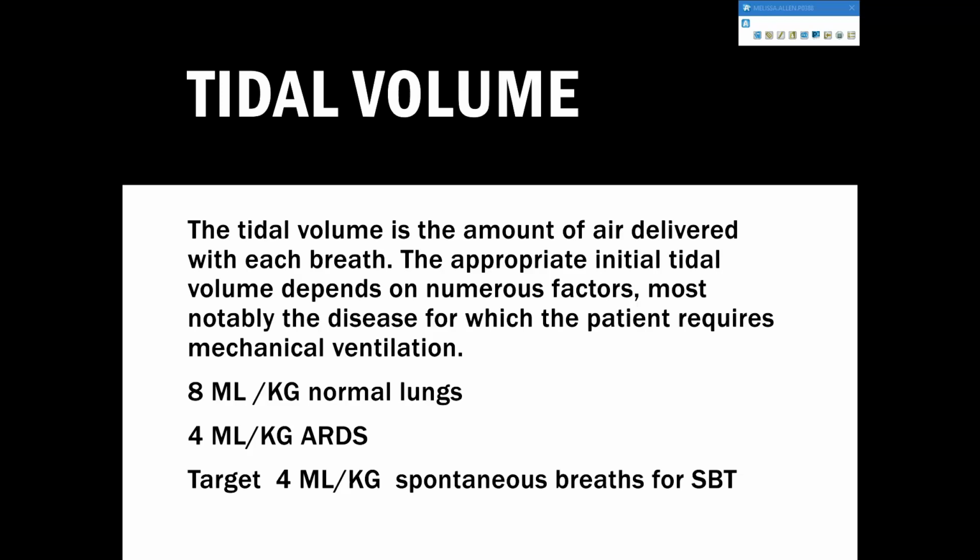So what we really want to make sure we're doing is always setting 8 mLs per kilo. I cannot tell you how many times we've seen 500 as a tidal volume. And this 500 is not going to be the same for somebody who could be a linebacker and has a wide chest and is 6'4" as it is for an 80-pound soaking wet female. Okay, we need to be setting 8 mLs per kilo tidal volume.